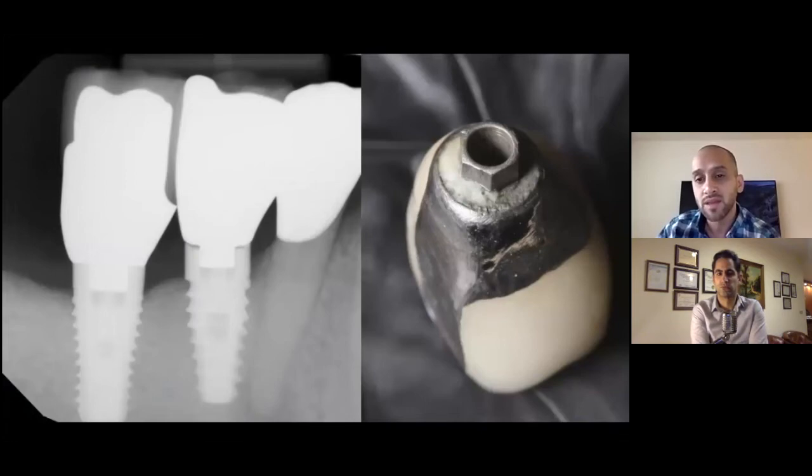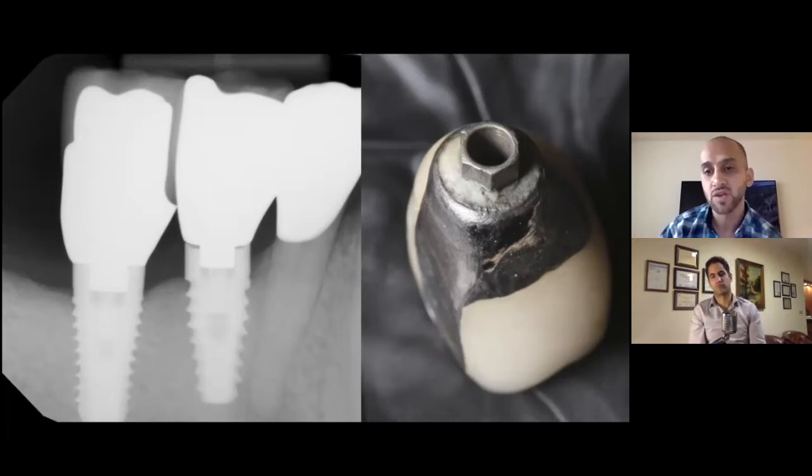Look at that plaque biofilm accumulation. Look at that connection, it's not pristine. You can see burn markings on there. You can see laboratory degradation. That connection is no longer the pristine connection that was intended to be coming out of the manufacturer. So there is some disconnect there. We are not really looking at the connection. So I thought we should be talking about these a little bit.